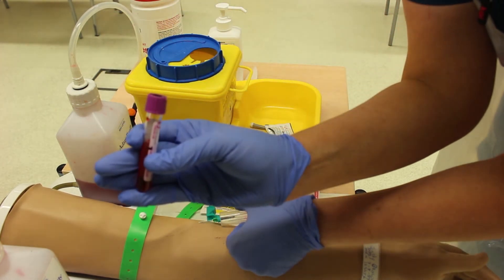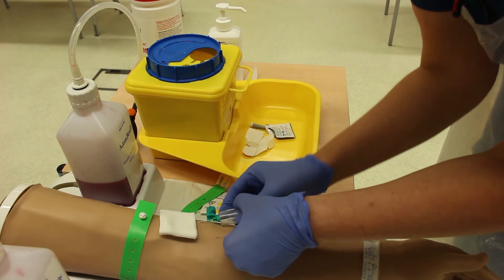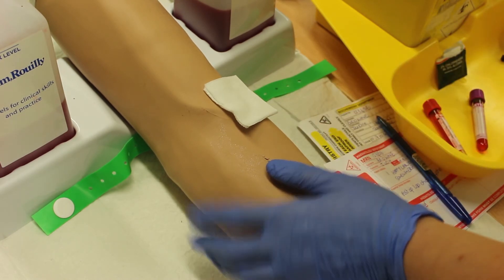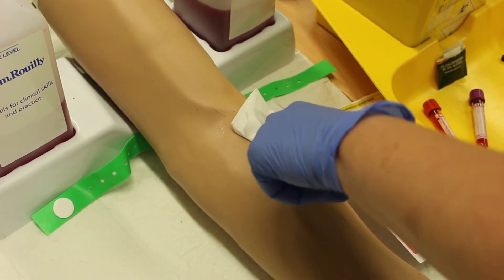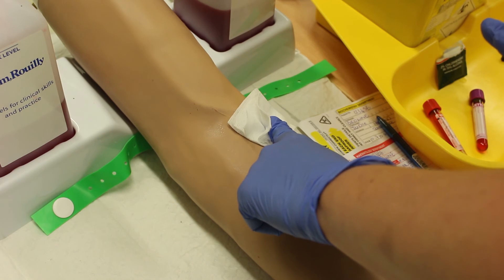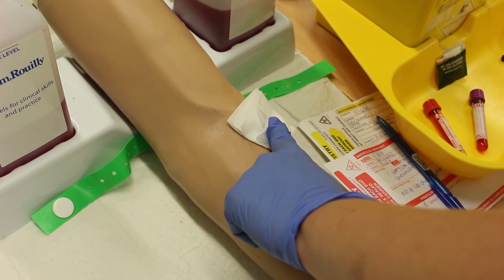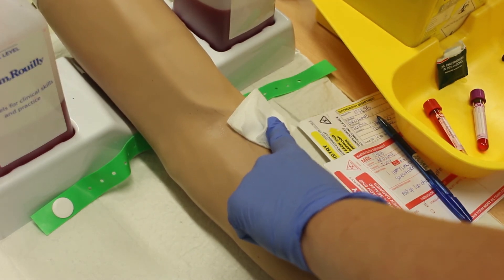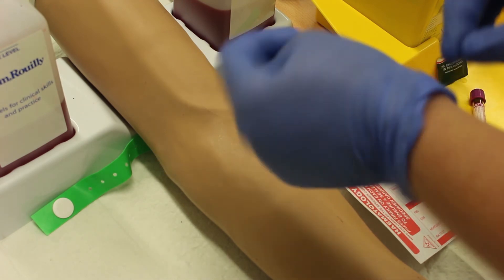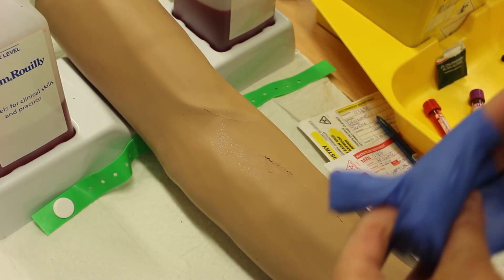Once I've drawn the last blood, I'm releasing the tourniquet. There is a marker on the blood bottle indicating how far to fill it. I'm placing gauze loosely on top, then removing the needle and activating the needle safety guard, discarding the needle into the sharps bin. I'm applying digital pressure with gauze over the site — keep the patient's arm straight, as bending can lead to hematoma formation. It can take a few seconds up to a minute to stop the bleeding.